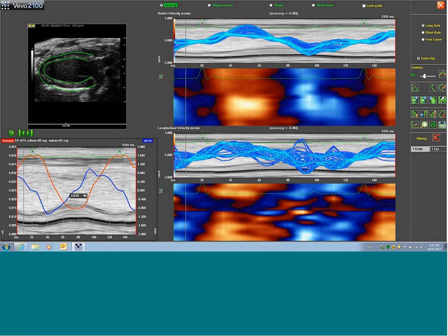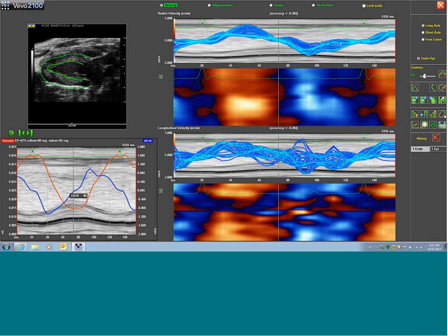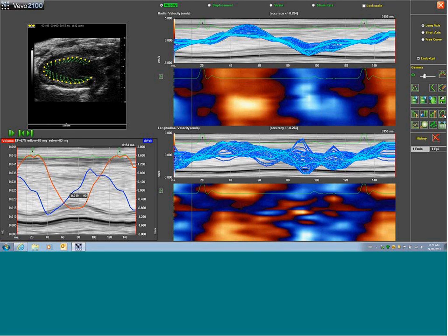The next thing I want to bring to your attention is the vector button. Over at your right-hand side, you can press the toggle contour vector orbit line or B mode. What this is going to do is place those vectors on the endocardial wall. It displays the movement of each of the 38 points that are along that contour. I toggle through this button to change the different types of vectors being displayed.